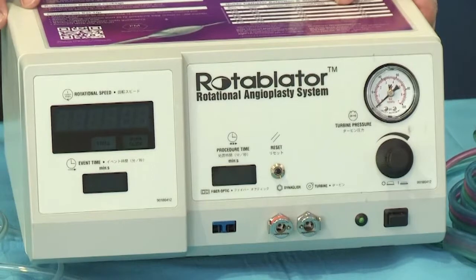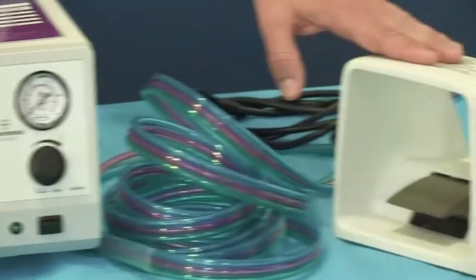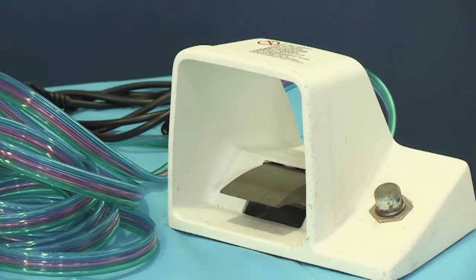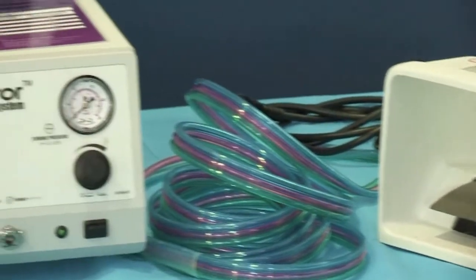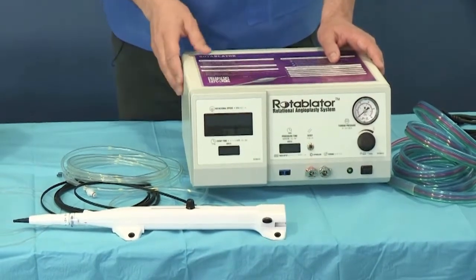In addition, what has changed as compared to the current system with the ROTAPRO is this piece that has disappeared. So there is no need anymore to have the pedal in the cath lab. Everything will be on the cath lab table at the control of the operator. If you're interested to know more features about this system, you can always refer to the available videos on PCR Edu Online.